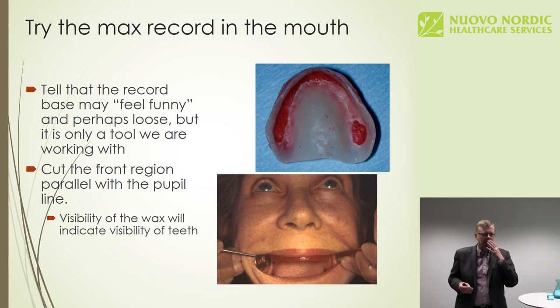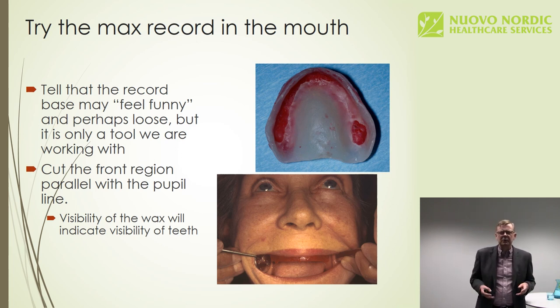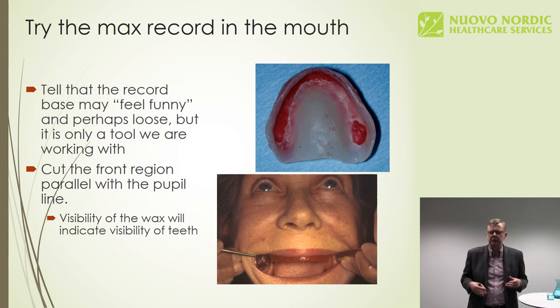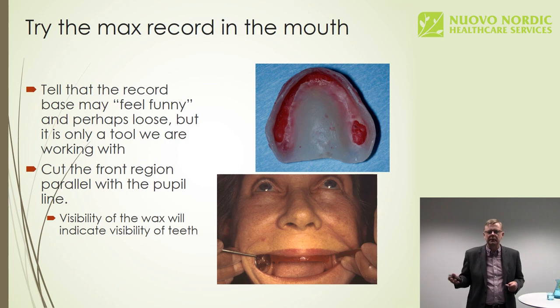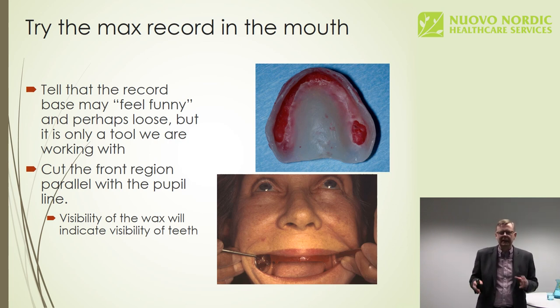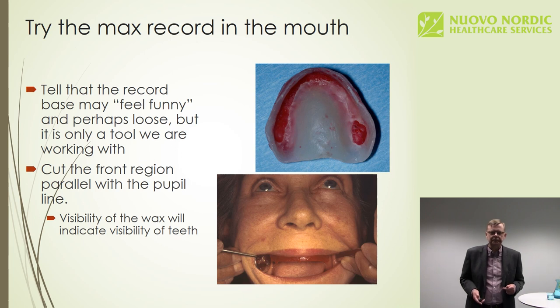If the upper lip is long, the teeth tend to show a bit less than if the upper lip is short. In that case, people usually show more of their front teeth. So anyway, this is something you will learn somewhere else reading a book. The aesthetic aspects, we haven't got much time for them in this lecture.